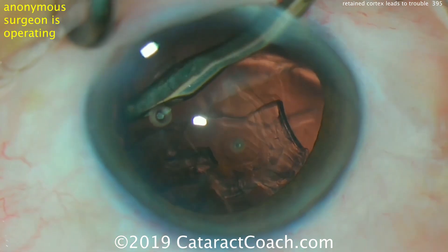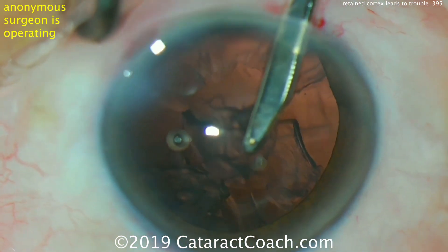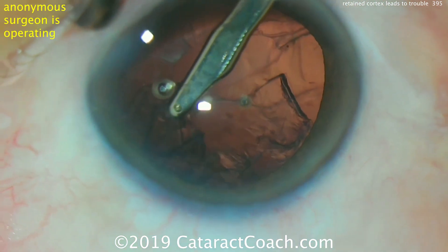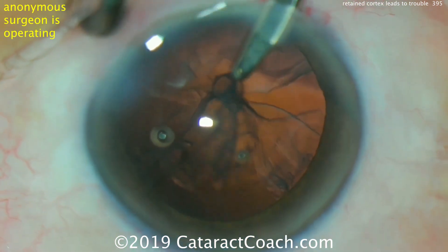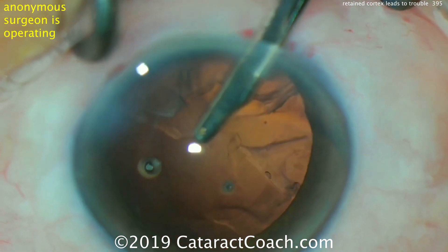This is a case sent in by an anonymous surgeon. At the end of the case, a good capsulorrhexis has been done and now the cortex is being removed very carefully. The question is: can you leave some cortex in the eye at the end of the case?